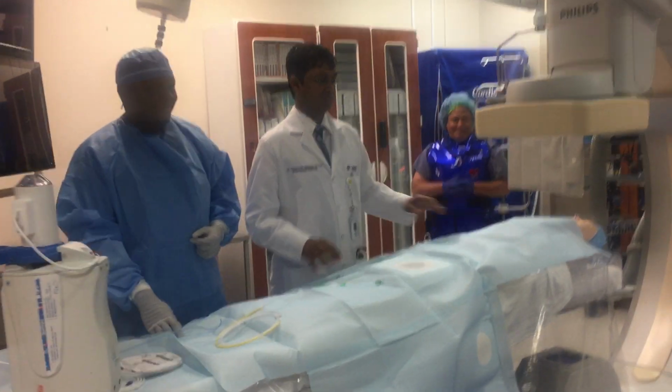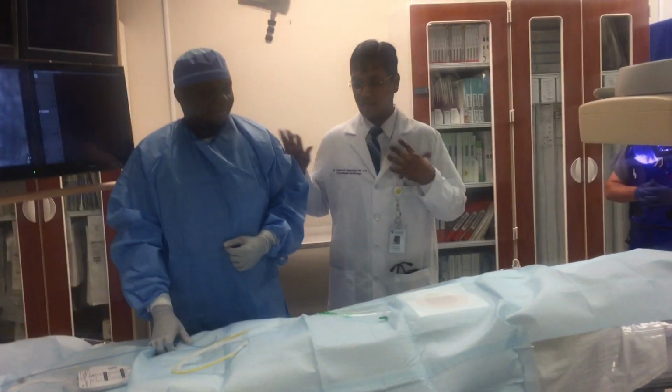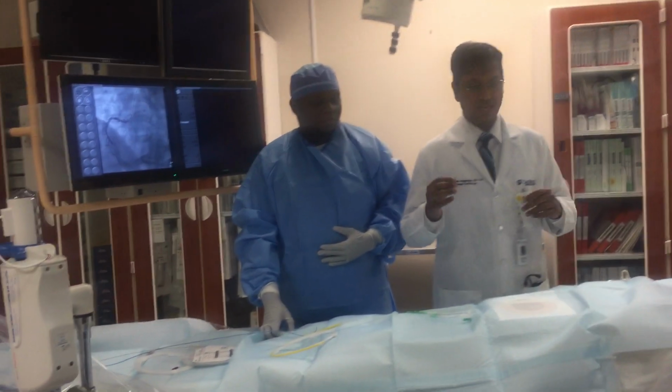So this is not a patient really, it's a mannequin. We just set it up for this purpose. I am usually like Mike, scrubbed into a sterile suit. Today we can't do that.